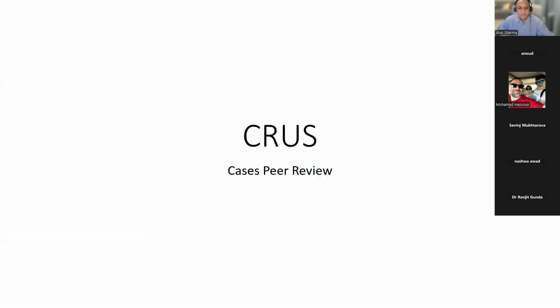Audible and visible. This is my first scan, a cranial ultrasound. I will present this case just to see if I'm getting good views or not. There is no pathology in this scan.